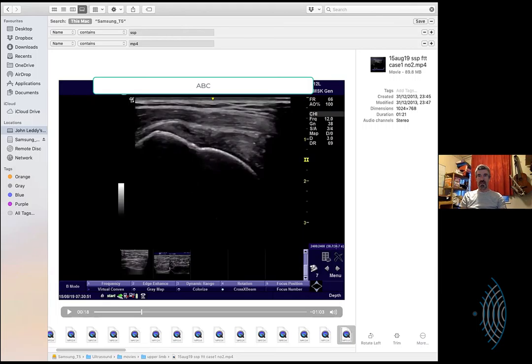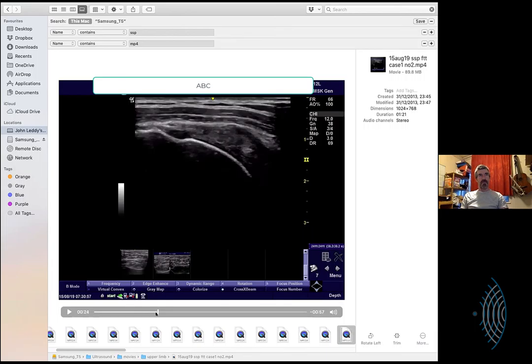And infraspinatus, just the superficial infraspinatus fibers have just slumped down into that space. Those would have been actually on top of the fibers that would be perfectly represented in long axis if they had not been retracted. Yeah, and they'd probably be less edematous, so they'd be thinner. So you wouldn't really notice it so much. Yes, no, I'm with you.